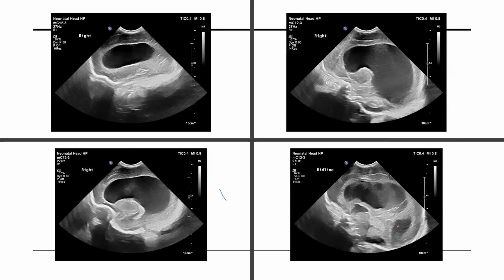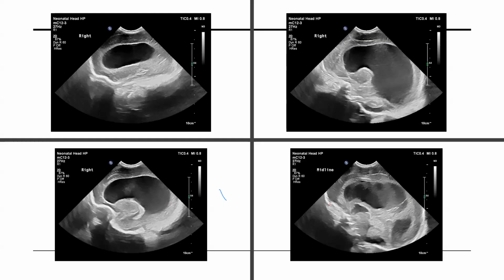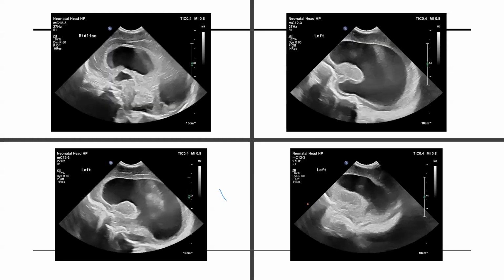Again, can you see the exudate here, the irregularity? This is not clot, this is exudate. Very irregular. You can see septation in the ventricles. Very bright corpus. This is the corpus callosum remnant, but very bright septation here, very bright inner lining. That's the remnant of the corpus callosum that you see at the top there. Again, very bright lining. This is the left side. And can you see exudate? So this doesn't fit with clot. Once you start seeing septation like this, which is new, this is post-infectious.